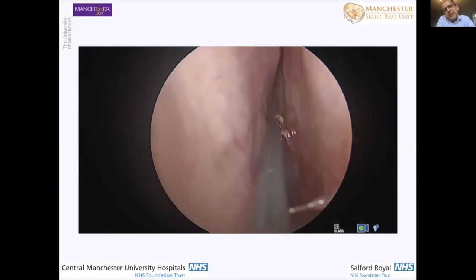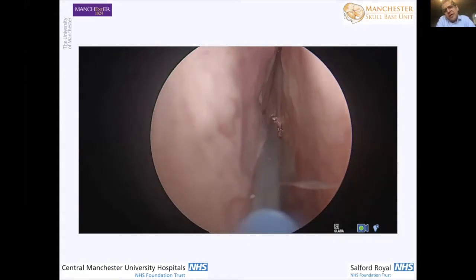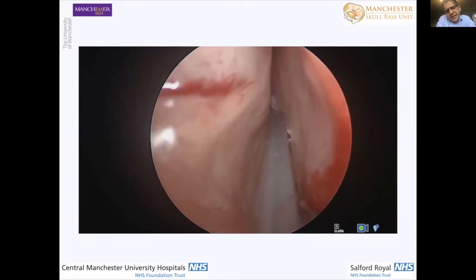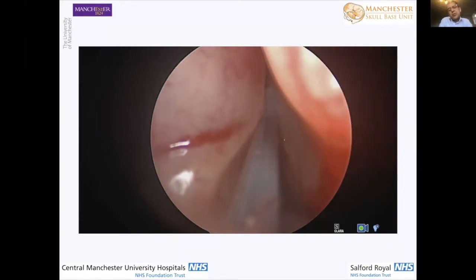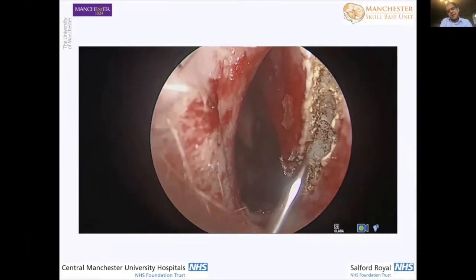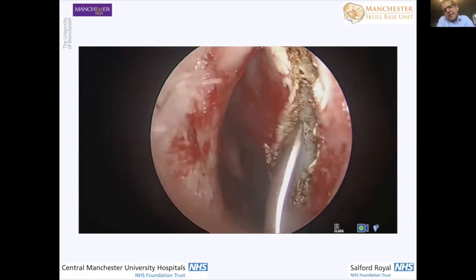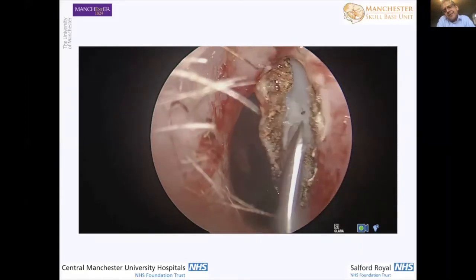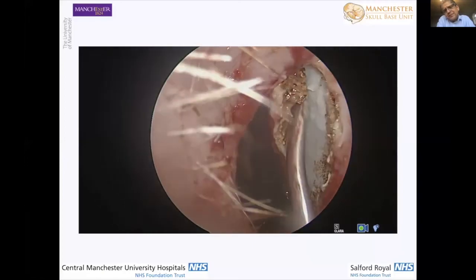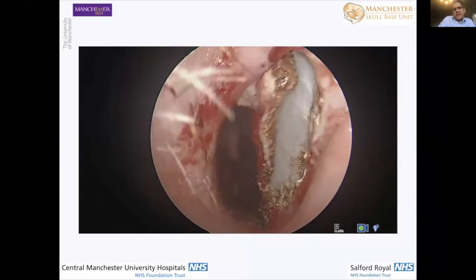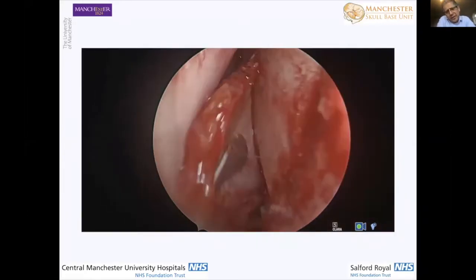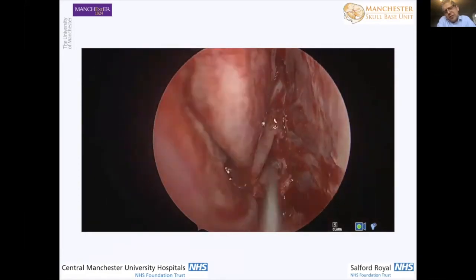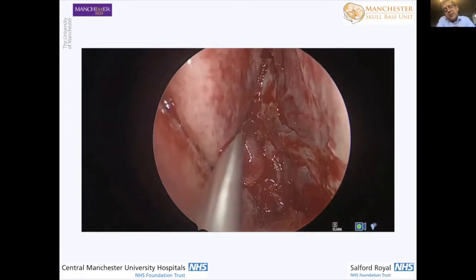Coming forward medial to the middle turbinate, coming forwards often underneath the olfactory fibres, and then once at the head of the middle turbinate, taking that flap further up towards the vault of the nose, and then anteriorly. The upper incision with monopolar diathermy links up to the incision that comes along the floor of the nose, anterior to the incisor canal, then dissecting in that submucoperichondrial plane. That's an avascular plane, and once it's been dissected and working along the floor of the nose posteriorly, you've got a very nice vascularized, healthy piece of tissue to reconstruct your clival defect — quite a versatile graft.